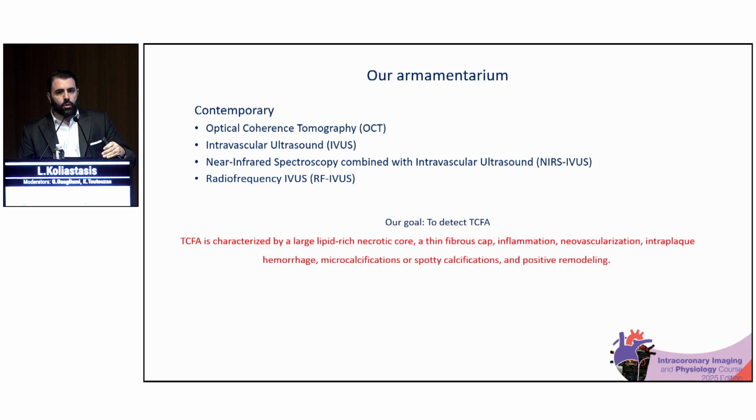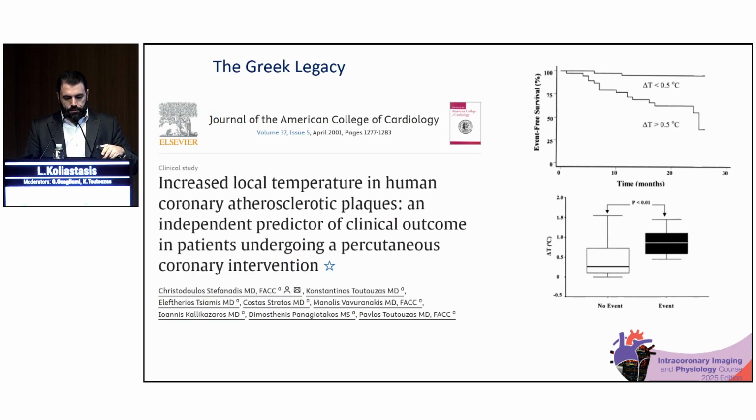So, what is our goal? To detect the famous TCFA, thin cap fibroatheroma. And if you see this definition, it's quite large, and we should keep in mind that the two things, large lipid-rich necrotic core and thin fibrous cap, as we may see in the next slides.